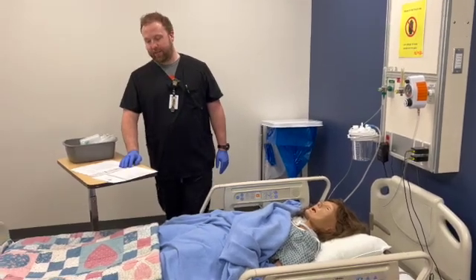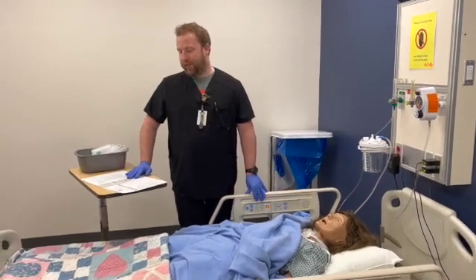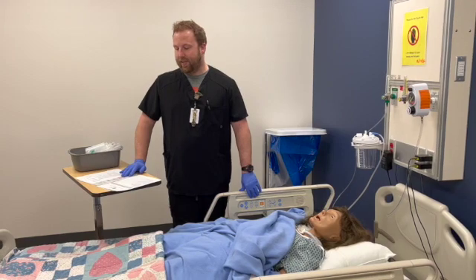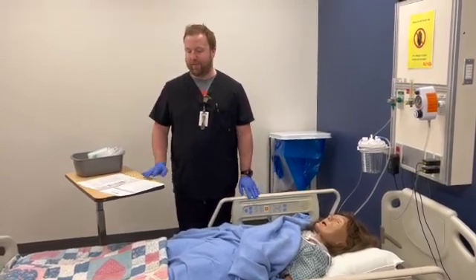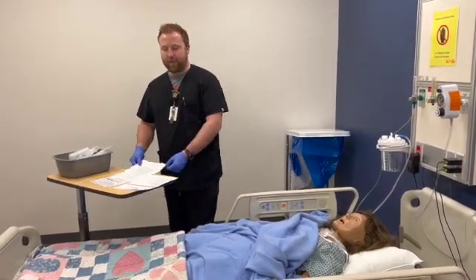Alright, today we're going to go over Unit 8: inserting an NG tube, suctioning and care of the NG tube, NG medication, care of gravity pump and feeding, and finally the removal of the NG tube. First thing we want to do when we go into the room is verify our orders.